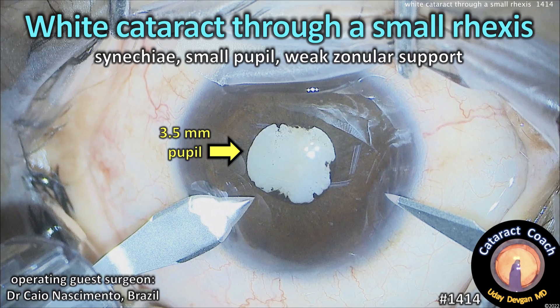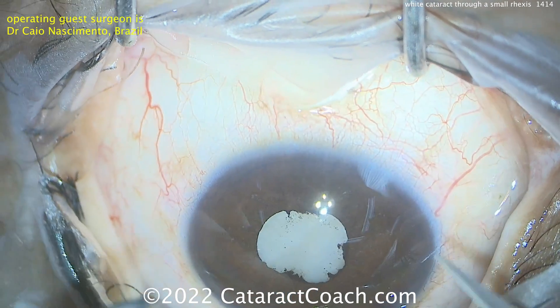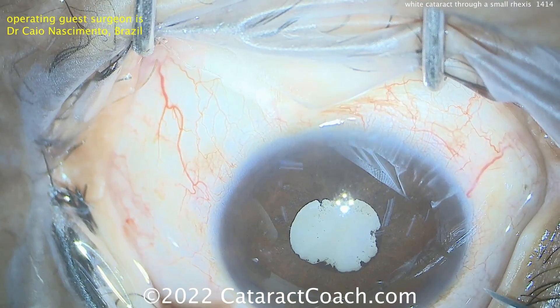CataractCoach.com. White cataracts through a small capsulorhexis — synechiae, small pupil, weak zonular support — is a tough case. Our guest surgeon here is Dr. Nascimento from Brazil, and you can see this patient has a small pupil.